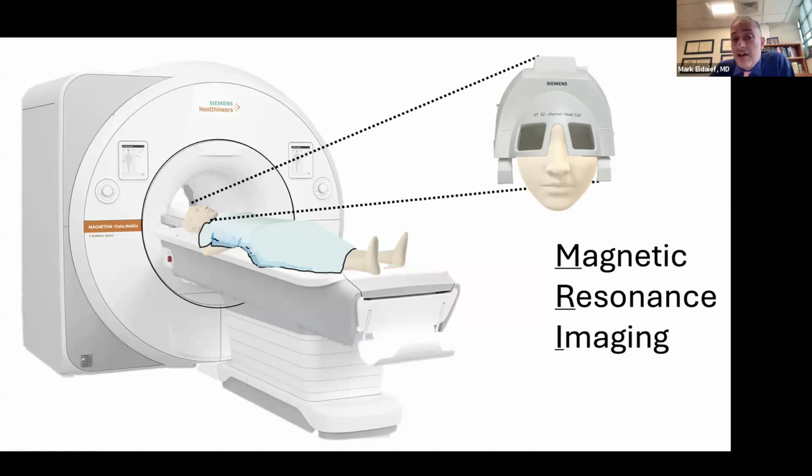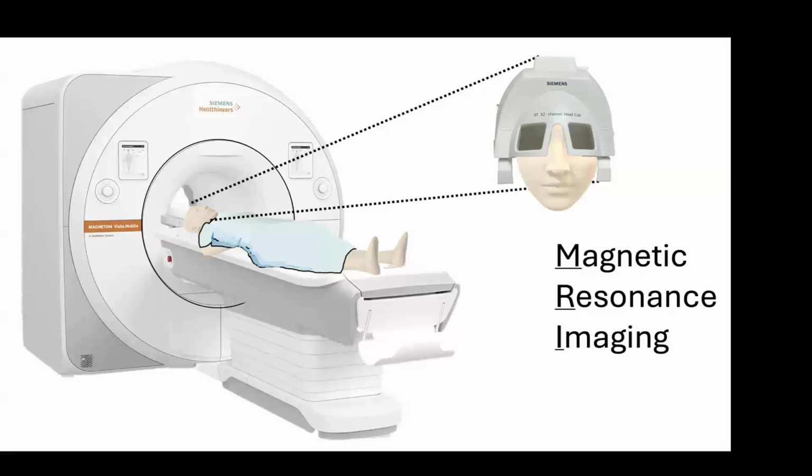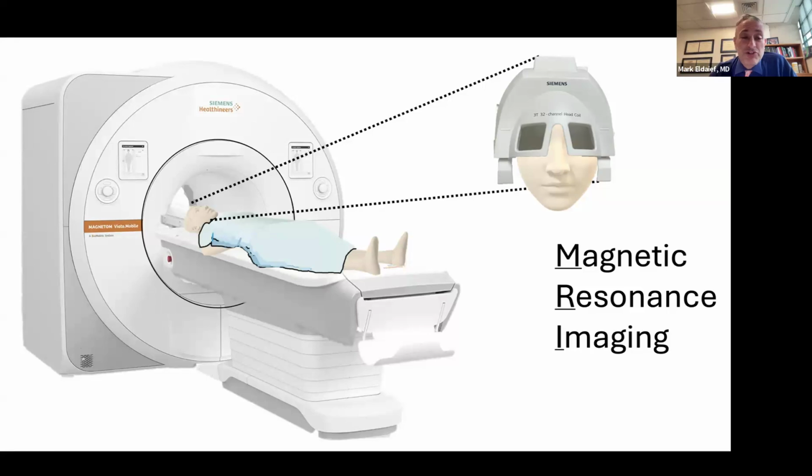Now, nowadays, a lot of the metal that people have in their body is still safe in an MRI machine, because MRIs just became so popular and so common that surgeons, when they were doing like hip replacements and knee replacements and things like that, would use things like titanium and not use things that the actual magnet would pull on. So many things are safe, but we're very, very careful to make sure that we don't introduce any metals near the machine, because they will be pulled really fast into the machine.